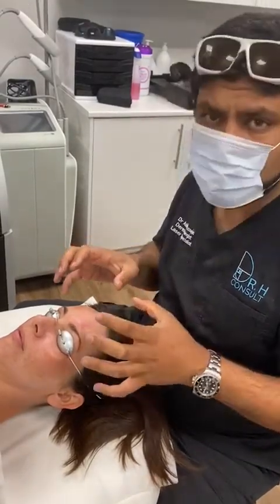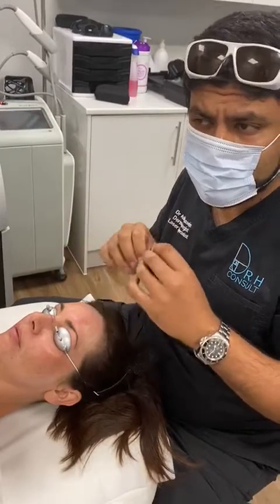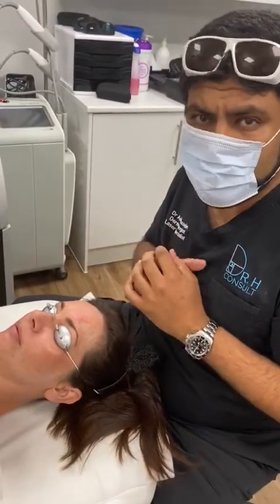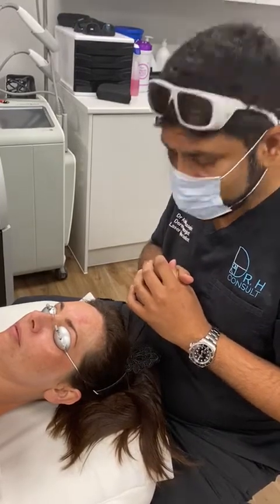And that's crucial in treating melasma, because if we're too rough with melasma treatment, all we'll do is incur a quick rebound of the melasma.